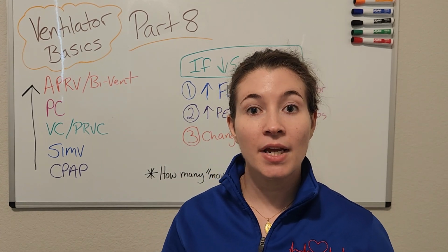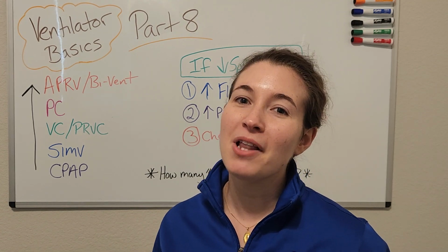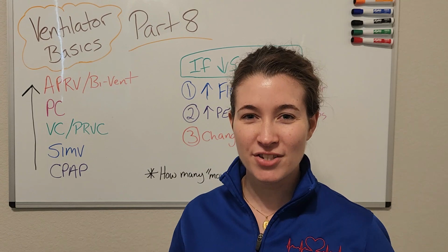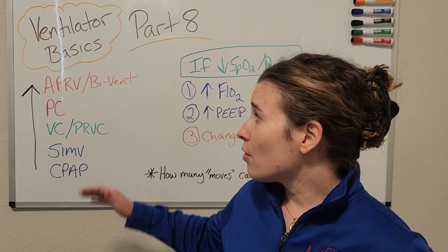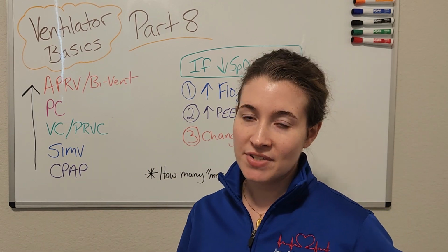In this video, we're going to be talking about how to put all of that knowledge together so that you can apply it to your patient at the bedside. So let's get started. So over here, I have all of the modes of ventilation listed that we've discussed.